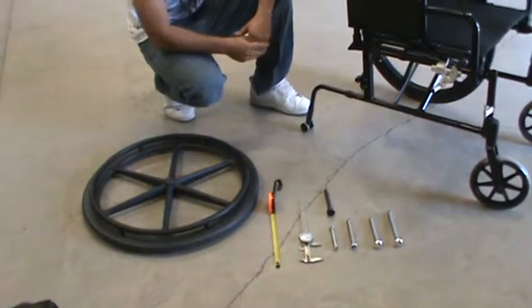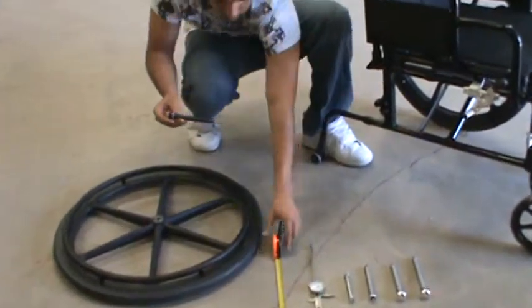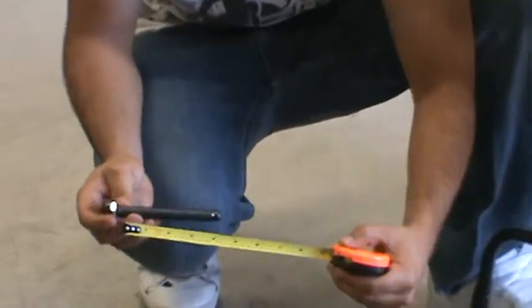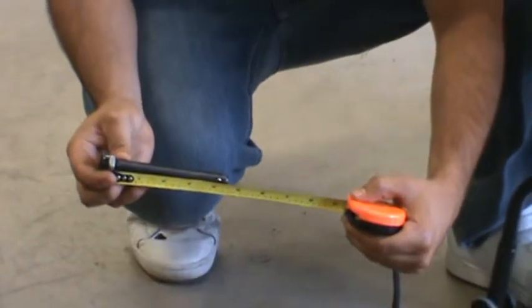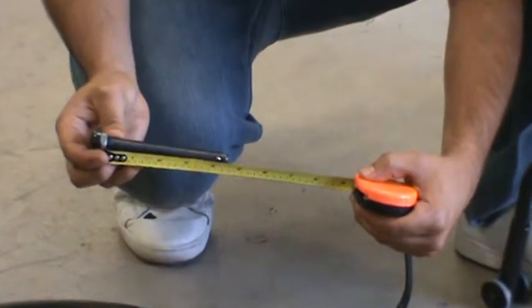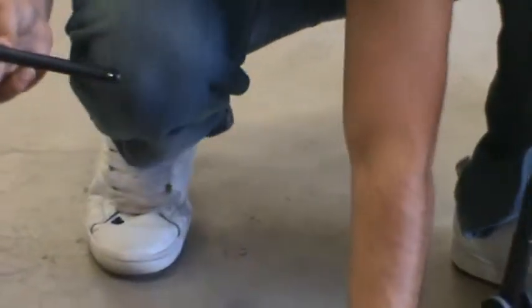Now to measure the axle, you can take a tape measure, measure from under the nut to the beginning of the ball. And this one is 4.2 inches. It should be correct for this wheelchair and rear wheel.